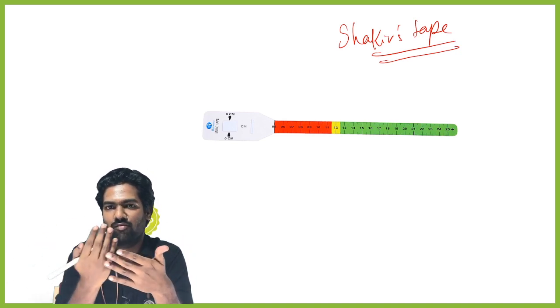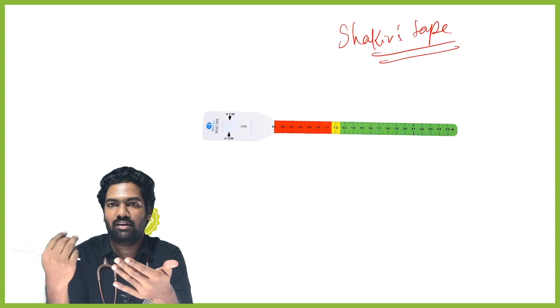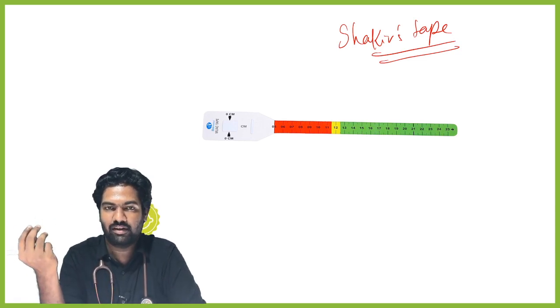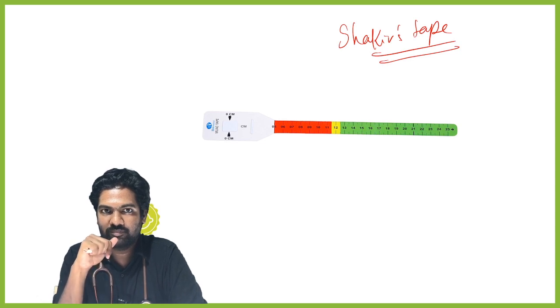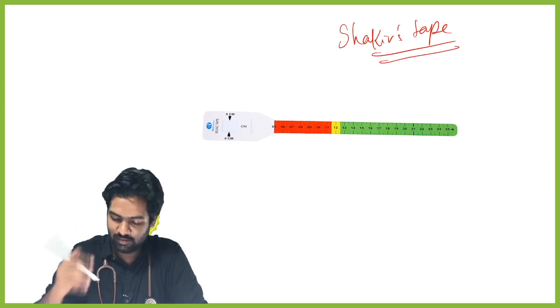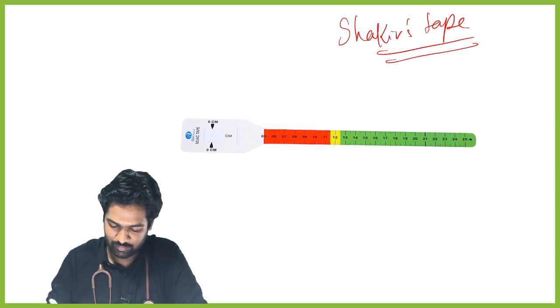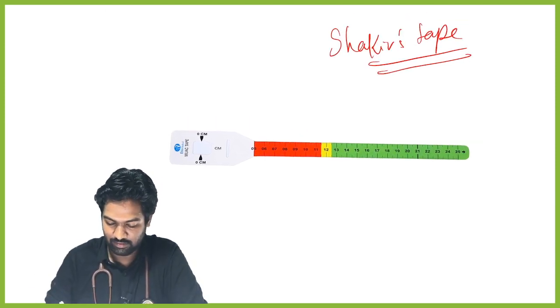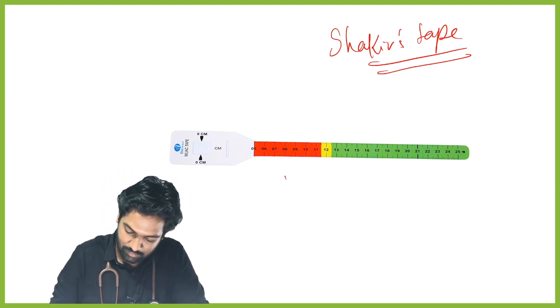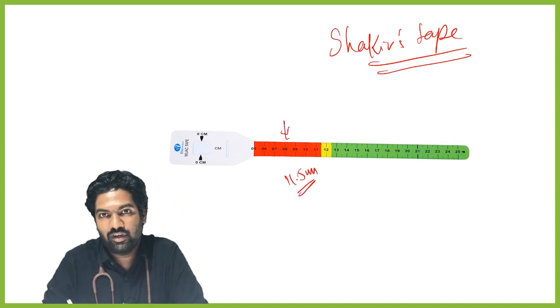Less than mid-arm circumference, less than this is classified as red, or undernourished, and which one is under green and properly nourished? Less than how many centimeters? You can see here it is very clearly available. Less than dash centimeters, it is going to be mid-arm circumference. The red starts from 11.5 centimeters, and from here it is going to be undernourished.